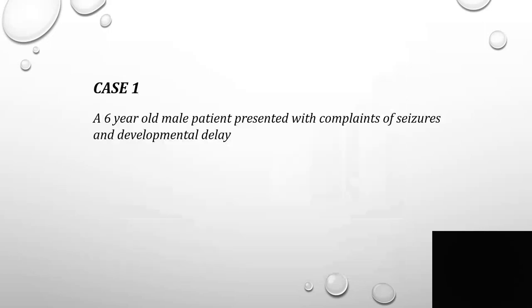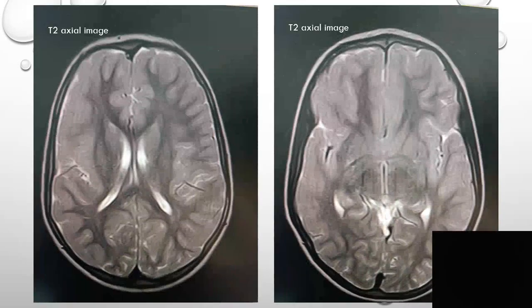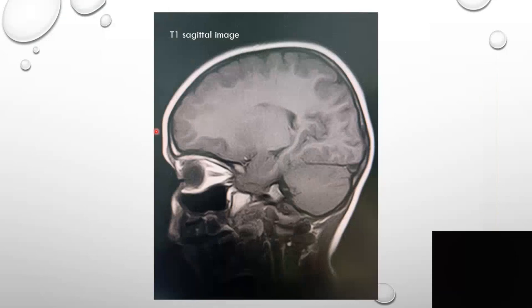Case number 1: A 6-year-old male patient presented with complaints of seizures and developmental delay. The T2 axial MRI brain image shows diffuse thickening and broadening of gyri with shallow sulci involving the right hemisphere, with poor differentiation of subcortical white matter and mild paucity of underlying white matter. The T1 axial image also shows diffuse thickening and broadening of gyri with shallow sulci. This is the characteristic appearance of lissencephaly-pachygyria spectrum.